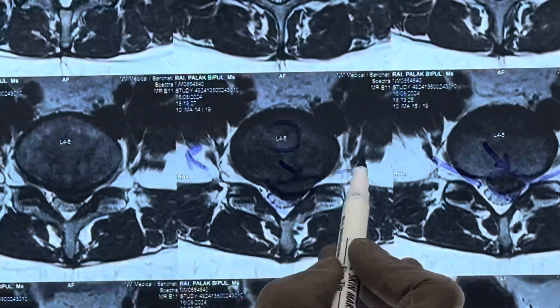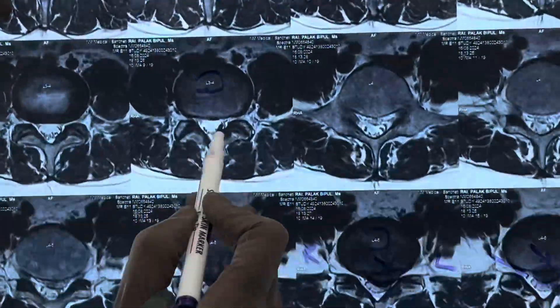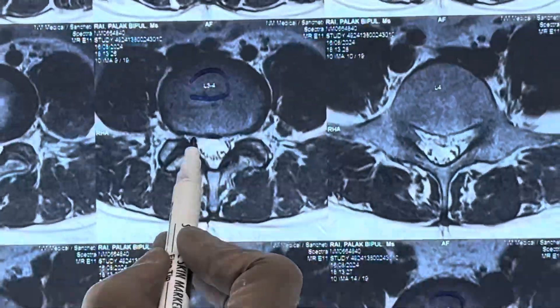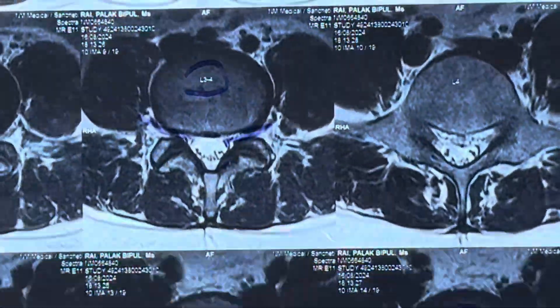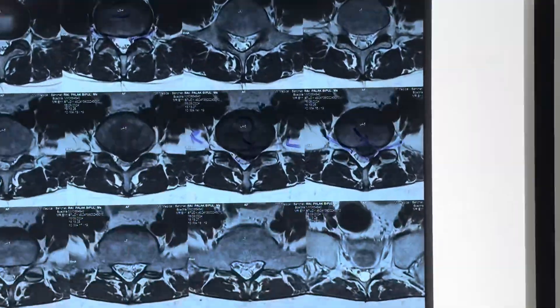This is the right side, this is the left side. If we see the normal level at L3-4, you can see this is the thecal sac, this is the right nerve and this is the left nerve. So we are going to do an endoscopic discectomy at this L4-5 level.